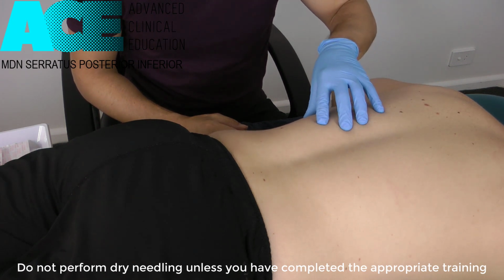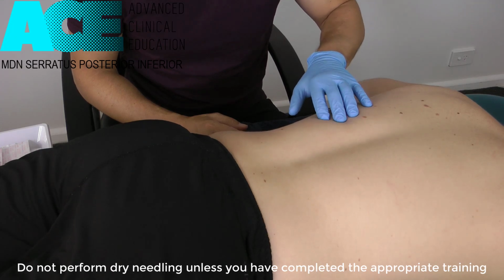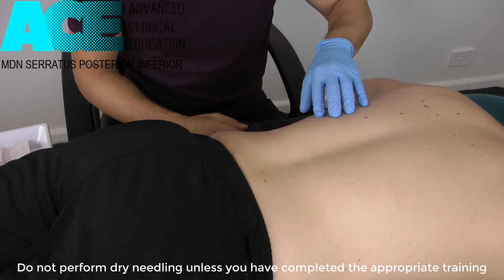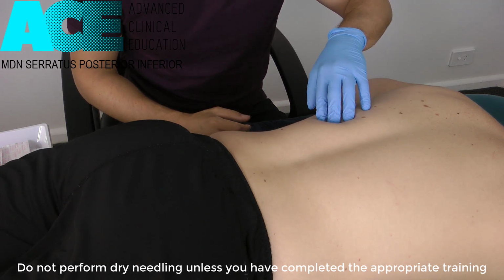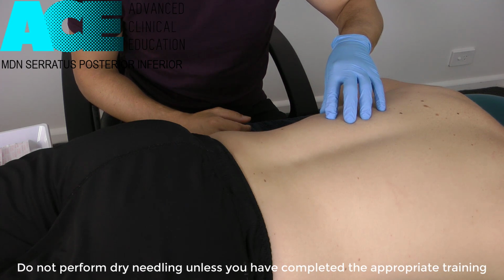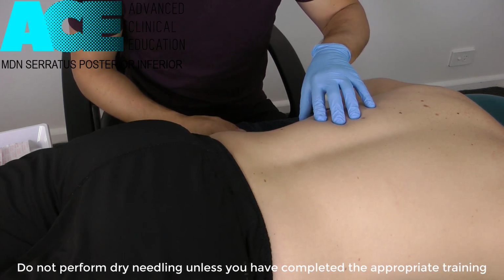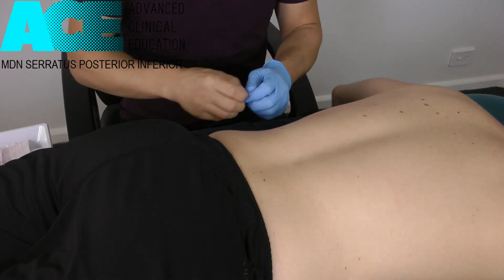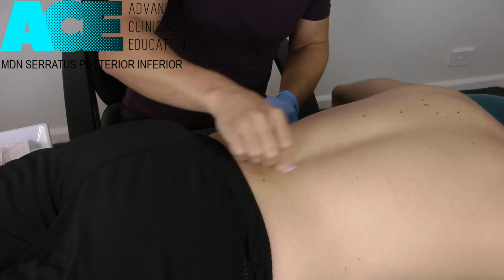Make sure that before you apply the needle, you get a really good sense and confidence with your palpation about how much tissue you've got to play with. Everybody has different amounts of body fat, and we need to make sure that we can confidently get down to the level of the muscle without compromising that lung. If you don't feel super confident about this because you don't have a really good sense of the depth of the tissue, I definitely recommend that you don't try this. Okay, so we're going to first of all clean that skin, make sure that we've followed our hygiene procedures.